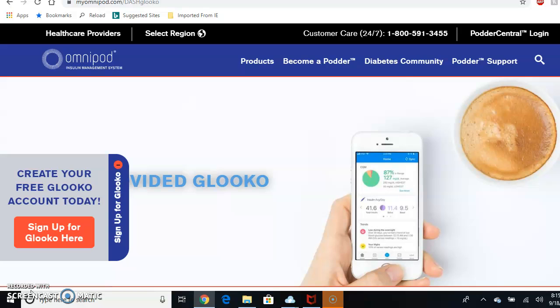The second video kind of hits home because my daughter has type 1 diabetes, and so we've been trying to figure out a way to best communicate with the teachers, the school nurses, as well as with our daughter as far as her blood sugars and maintaining that healthy lifestyle. So Omnipod, which basically makes a pod or a pump to allow type 1 diabetics to receive their insulin throughout the day. So this app works both for the Android and Apple phones.